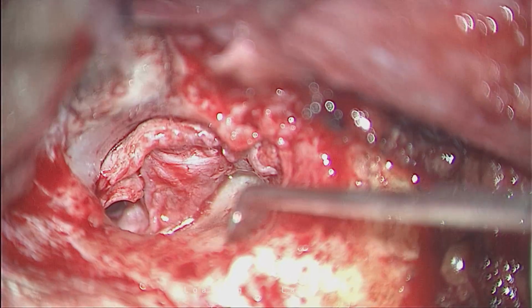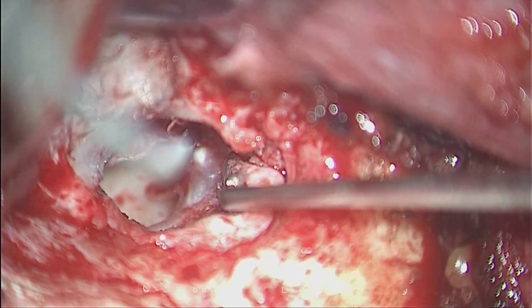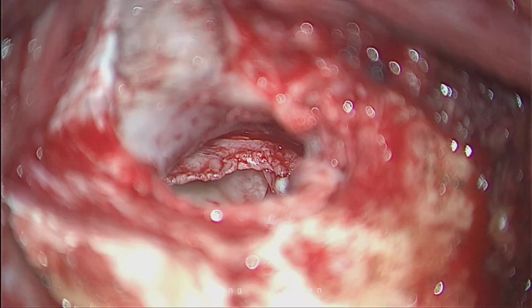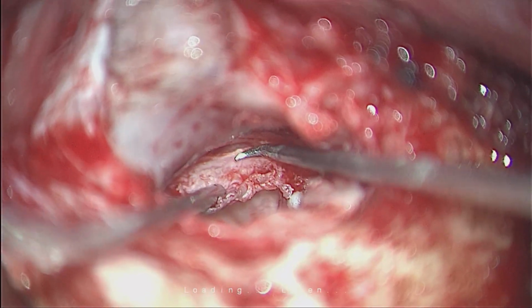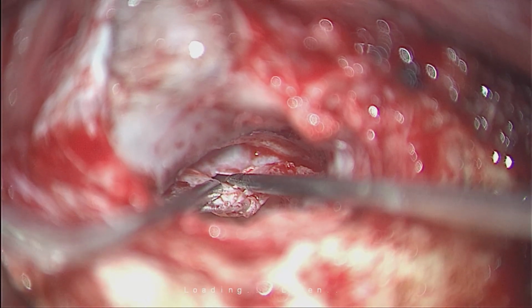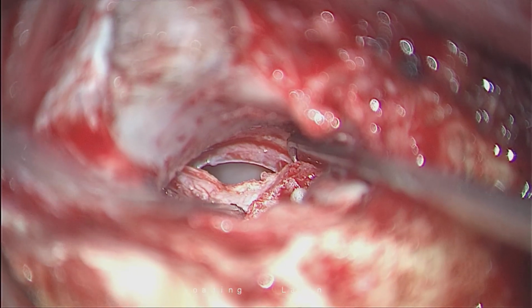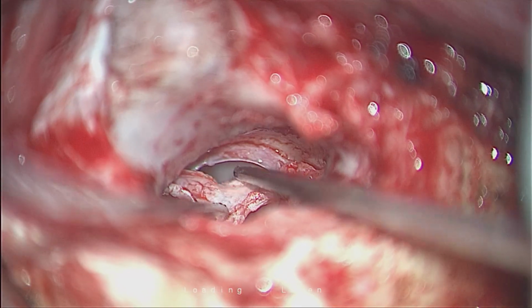Now the most important step, as I mentioned: we have to literally divide the tympanic membrane into layers. My next step is to separate this mucosal layer below from the rest of the two layers. Again, focus on this. This is a very important step, very simple but yet needs to be described. See this, my blunt angle. Can you see the instrument? See this mucosal layer below, and I am separating the rest of the two layers from the mucosa without traumatizing the mucosa. The best thing here is to separate off the mucosal layer and not traumatize it.